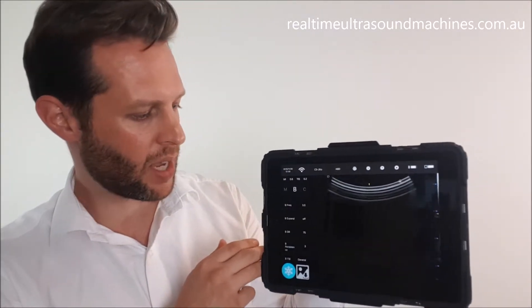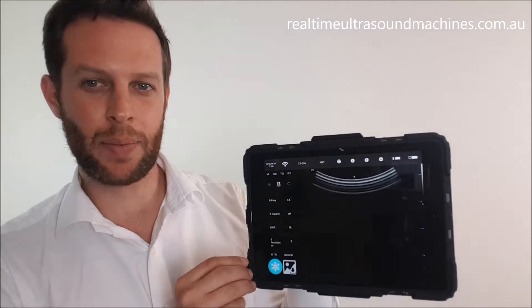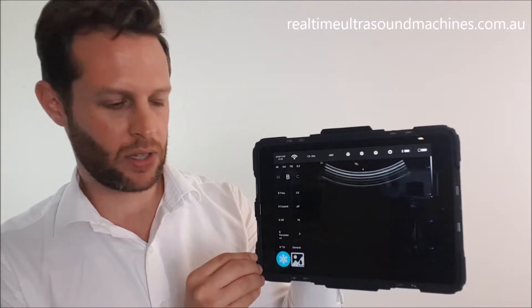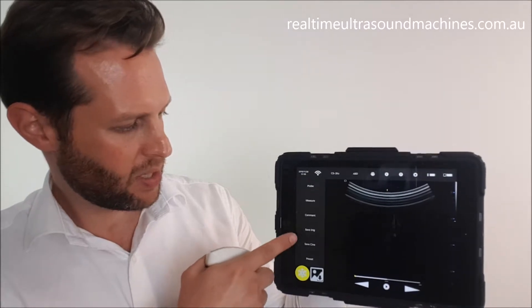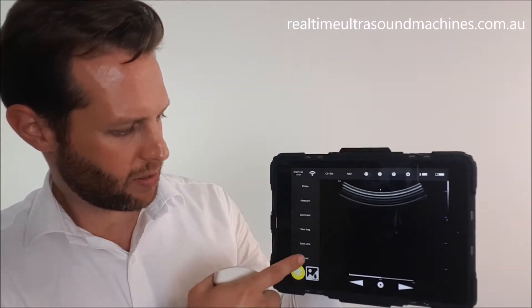The first time you do that, you might get a question from your iPad or iPhone asking if you want to allow this app to save things to your camera roll - just click yes. This little button down at the bottom will allow us to freeze the image. If we tap that, it should bring up a separate set of menus which will let us either save the cine loop or save the image.